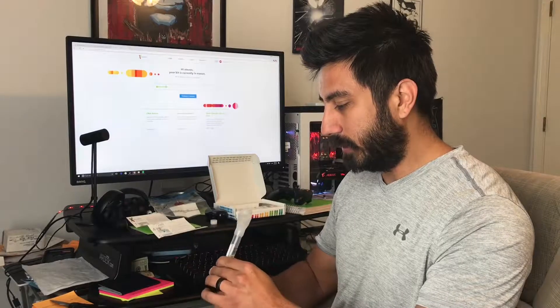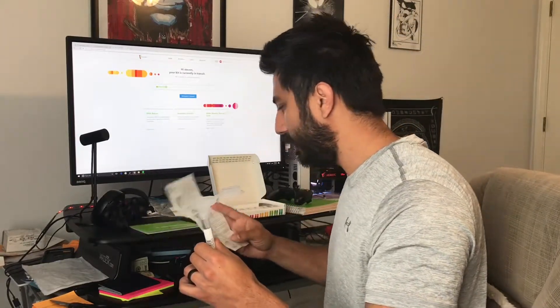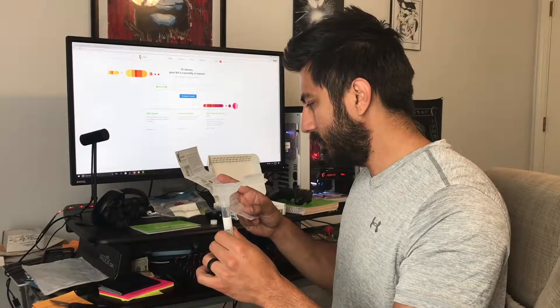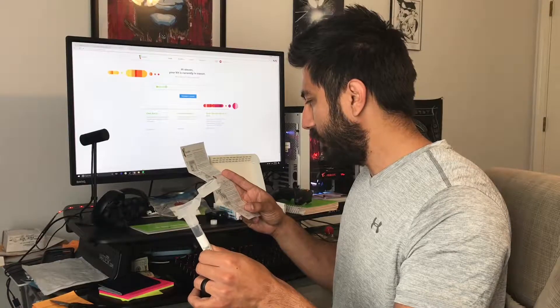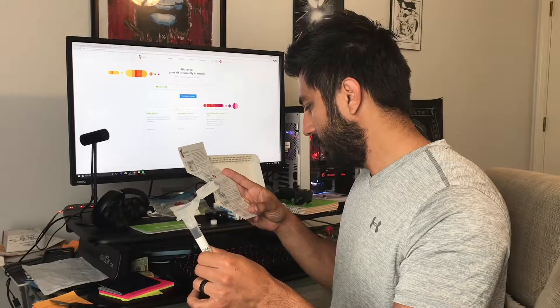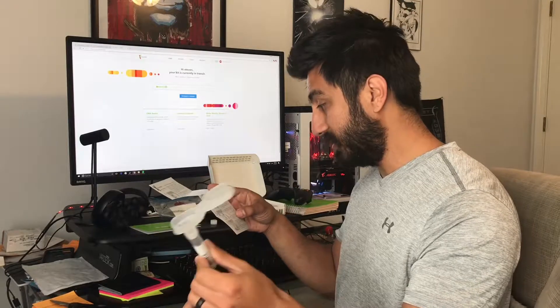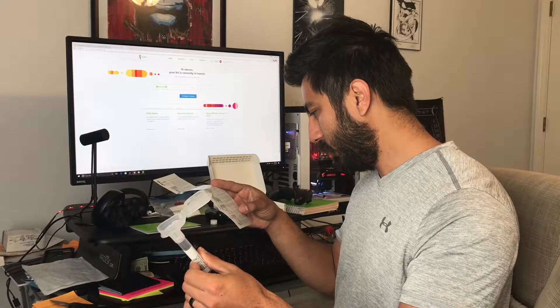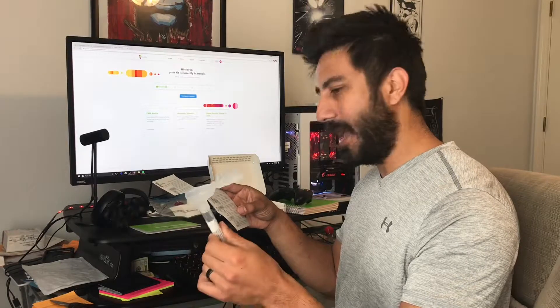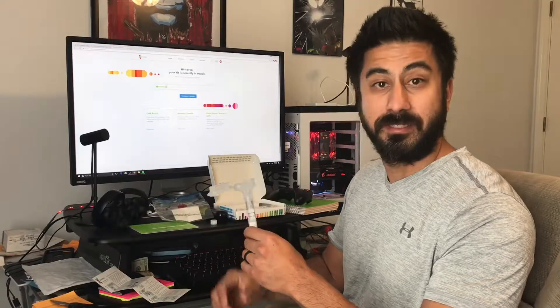You send it back and can track the package. We're going to fast-forward through the actual spit collection. The instructions say: spit into the funnel until the liquid reaches the line, then hold the tube upright with one hand and close the funnel lid with the other, pressing until you hear a click. The liquid in the lid will be released and mix with the saliva. Now fast-forwarding as I spit into the tube.